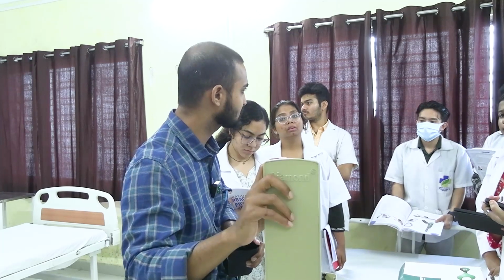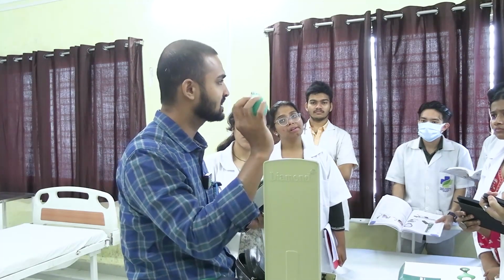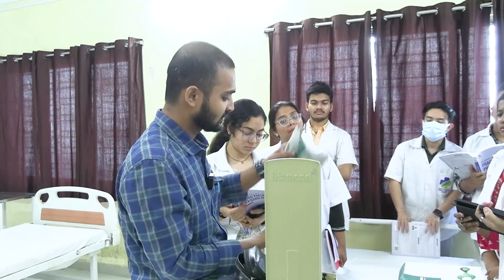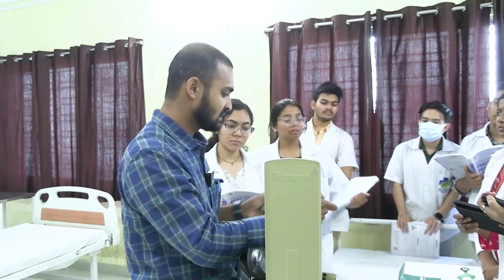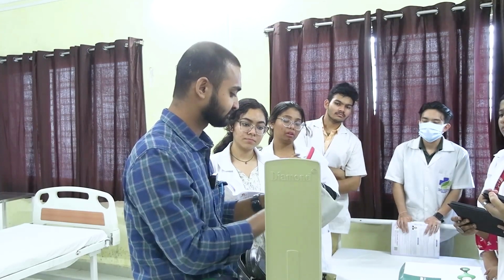There are other types of sphygmomanometers, like digital and aneroid. This is the aneroid, where we directly take the BP. Using this same hand valve, bulb, and this is the valve.